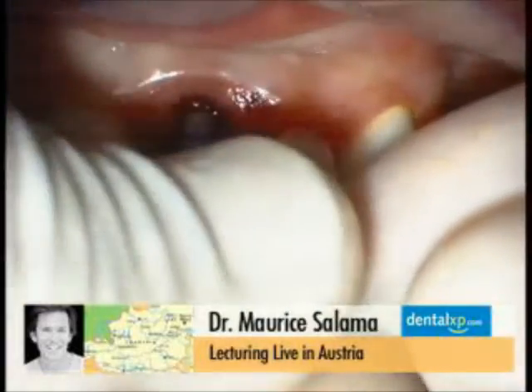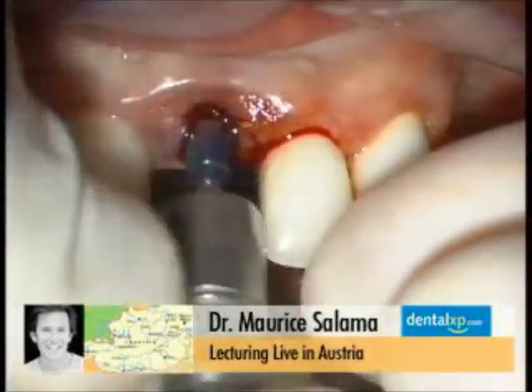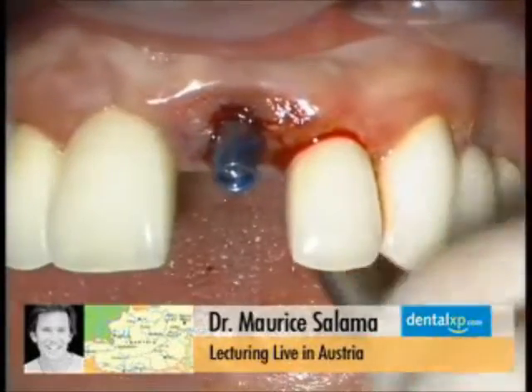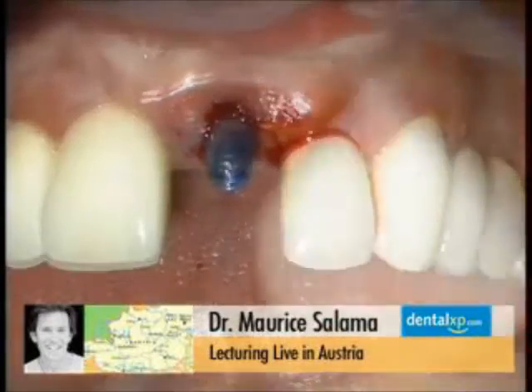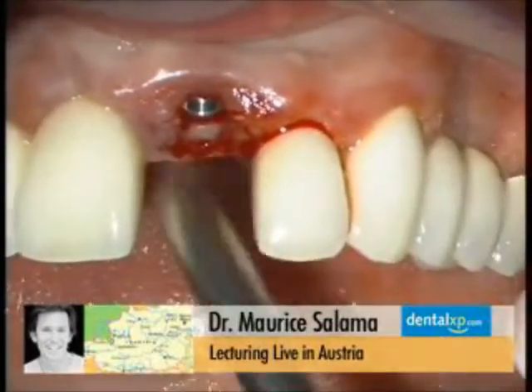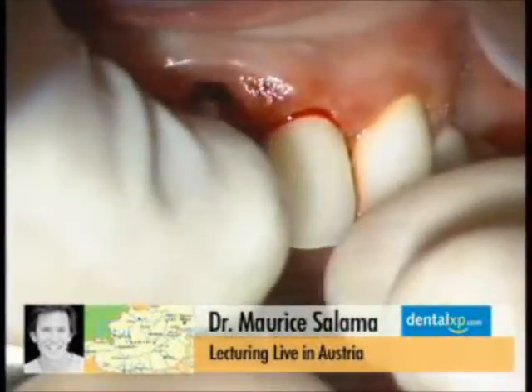We sutured over the top of the bone. It was screwed into place and maintained, and you can see the shape of this bone on the left side. What Henry's doing on the right screen here is simply following the surgical guide. It's going to be 15-degree angulation to engage the palatal bone, stay away from the labial plate. I'm going to do the next one.